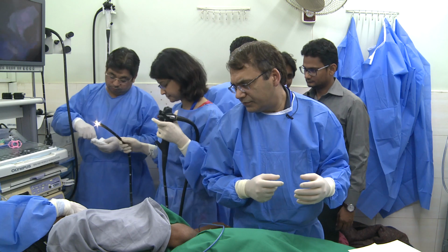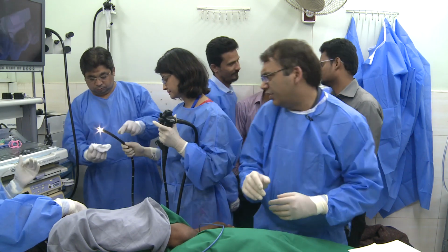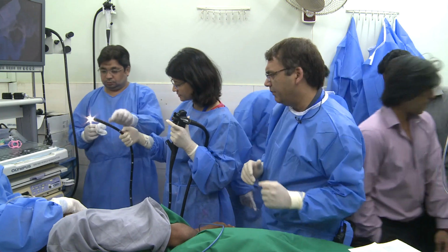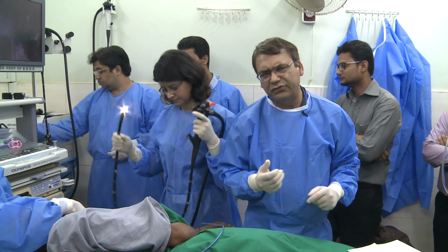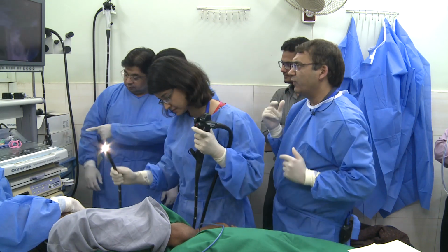It's a neck mass. I'm just talking in general. And I thought it was head, by the way. So it's a neck mass. And usually the neck mass, also if we're talking about the portal vein thrombosis and neck, head, sometimes the extension is there into the head as well. Okay.